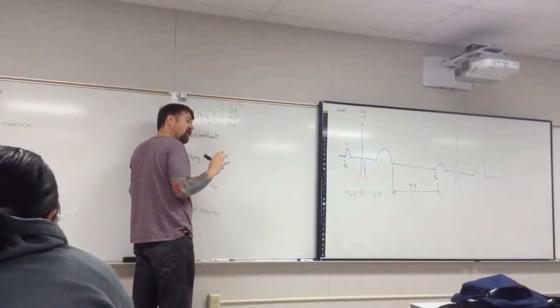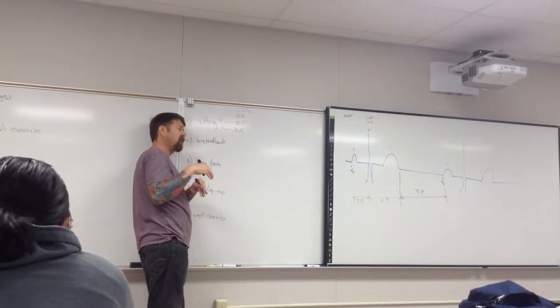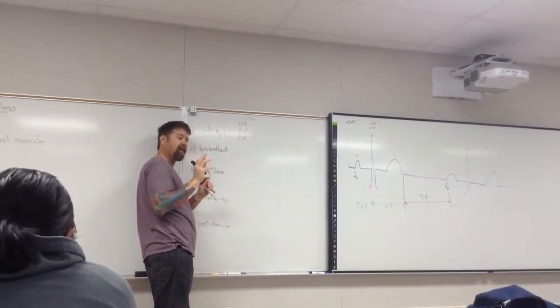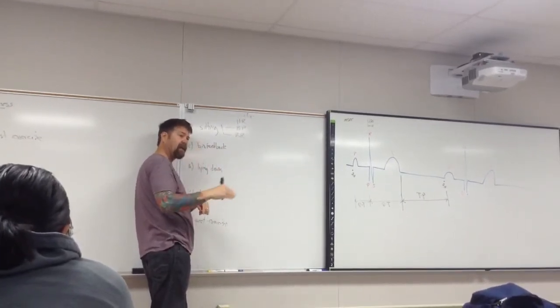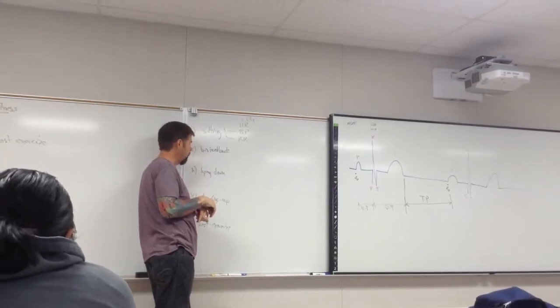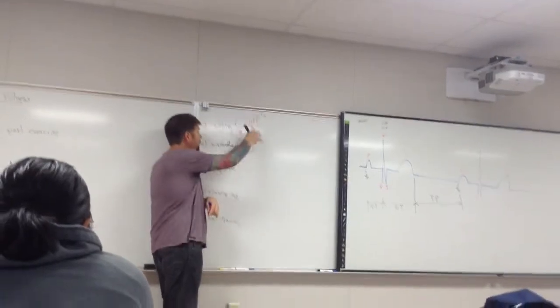Let them relax. Have them sit there with their eyes closed, relaxed for a few minutes. And then don't tell them you're going to start doing it, and then just start taking the data. But they need to have been sitting there for a few minutes to do that. You want them to try to get to that biofeedback mode, right? Get that parasympathetic stimulation going. So do that, and then write all these data down.